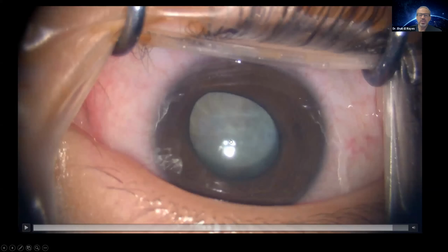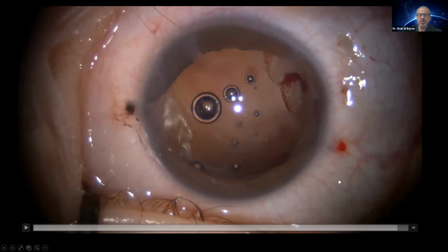So seeing a patient like this, we don't tell him no hope for surgery. But depending on the age of the presentation, the amount of the subretinal fluid, and how much the retina is closed on the ultrasound helps us in decision making to have an eye like this at the end. If you look at the operated eye and the unoperated eye, here there's no fixation at all. You can see the light, while the operated eye, 4 months after surgery, you can see that he has an open posterior pole. This is the residual peripheral traction, but it has nothing to do with the central pole. Your aim in stage 5 is posterior pole attachment, and this child is fixing with that eye.